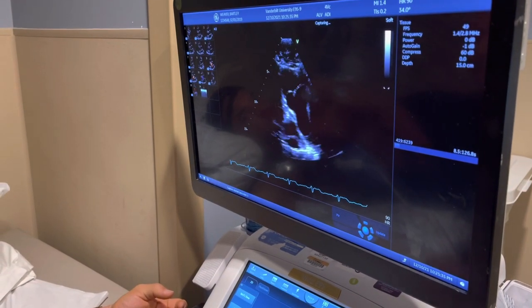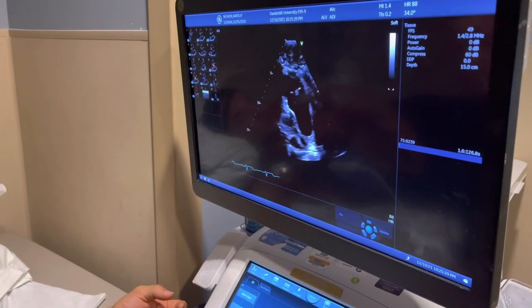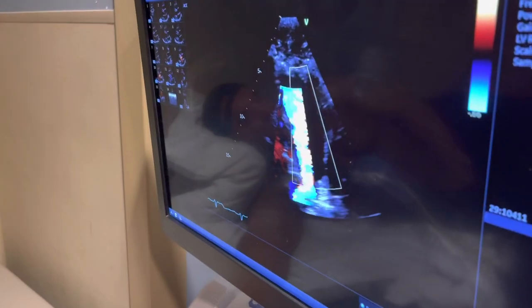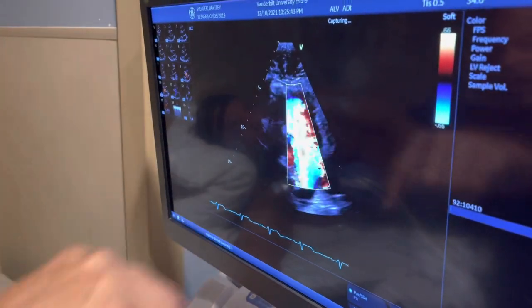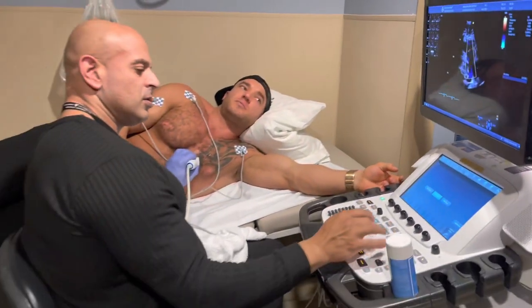This is the fourth valve — we saw three valves, but there are four valves in the heart. This is the pulmonic valve. That valve sends the blood to the lungs. We can see the flow there. How does that look? Perfect.